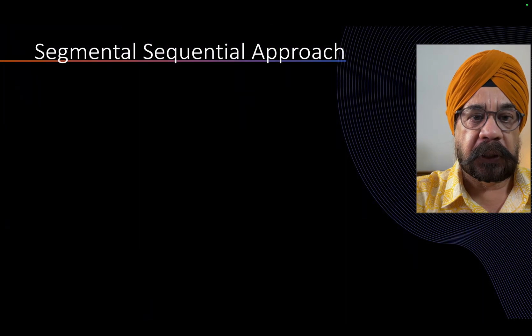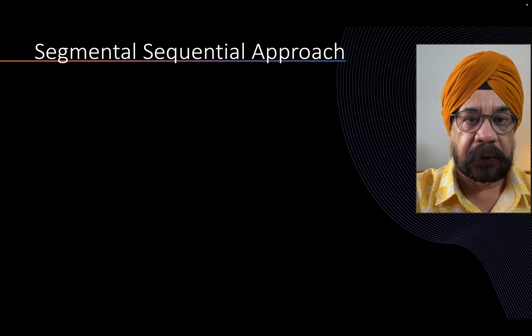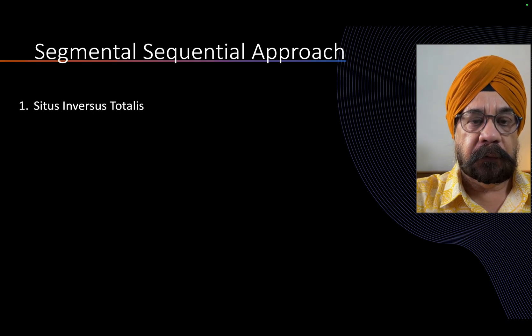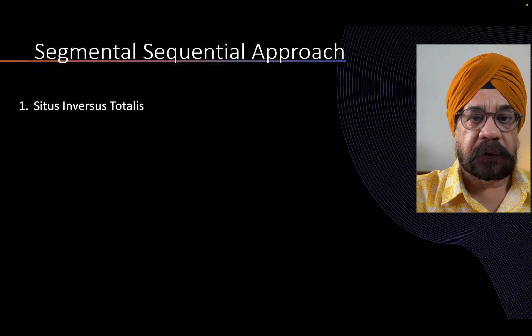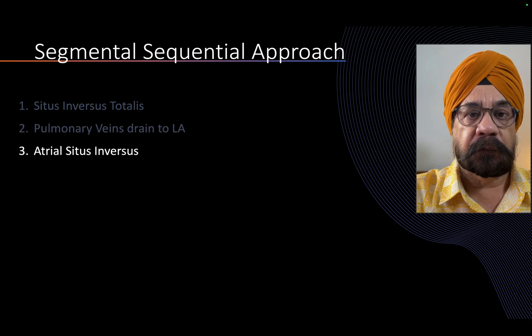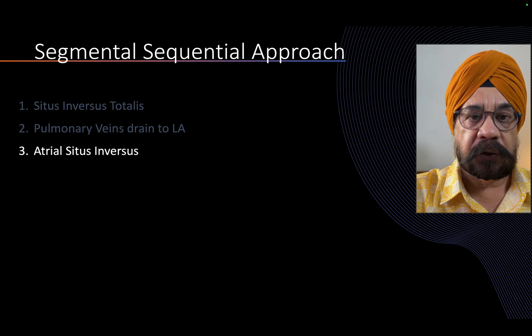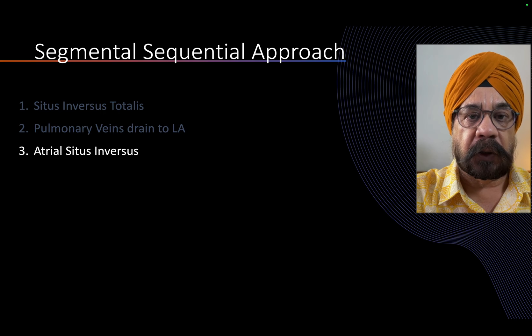According to the segmental sequential approach, this patient — this fetus — had the following findings. The fetus had situs inversus totalis. The pulmonary veins did drain into the left atrium, which was also on the right side. Normally it's on the left side, but because this is situs inversus totalis, the left atrium and all those structures were on the right side.